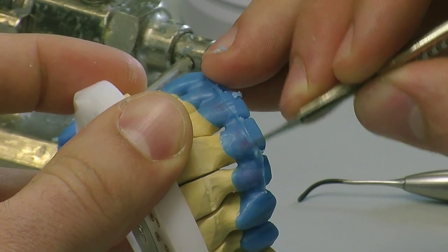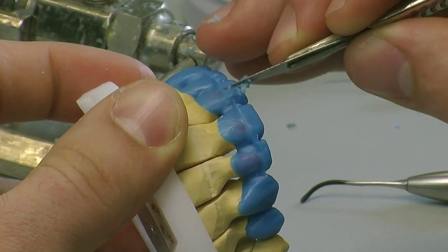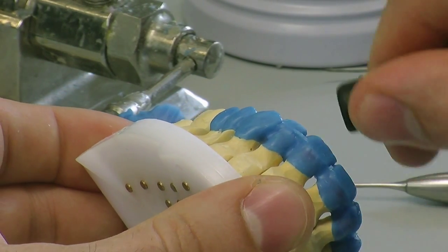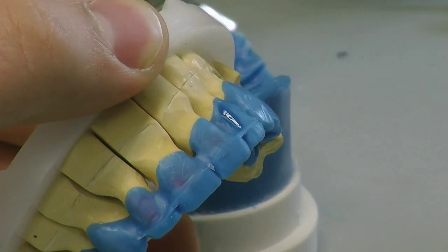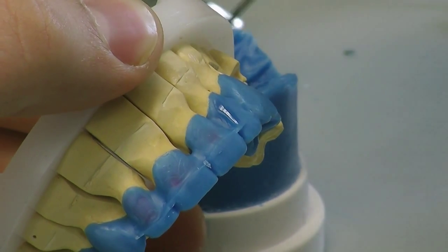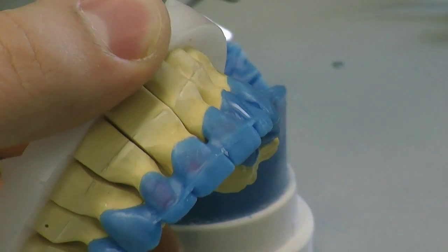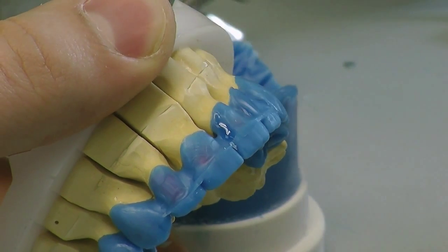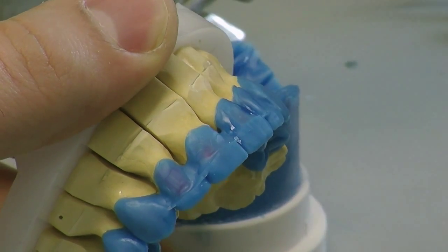This will be checked on the articulator and then we're going to do our cut-back in the wax which will allow for our porcelain application. Basically what we're going to do now is we're going to fill in the mesio and distal line angles, connecting our substructure wax up with our incisal edge addition and filling in all the margins. So we're now basically constructing full contour our anterior section, our two-to-two.